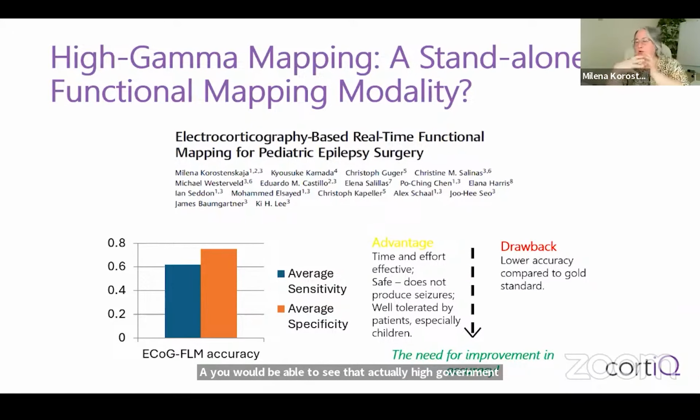So it was even closer to the spikes localized with MEG than any other modalities. Yeah, so in questionable cases like this it is a great support. Secondly, in those cases when we cannot perform cortical stimulation because we are causing seizures. In those cases also, I was actually asked to come quickly on the weekend because the patient was rushed to surgery, but we still didn't have results from cortical stimulation because of the seizures. So in these cases, high gamma mapping was absolutely invaluable.